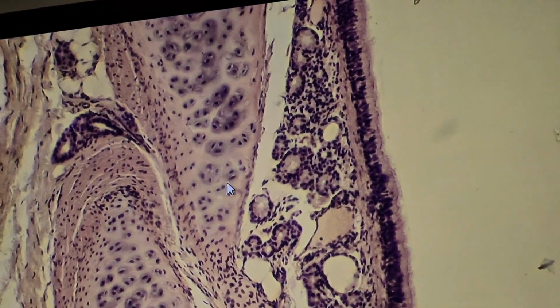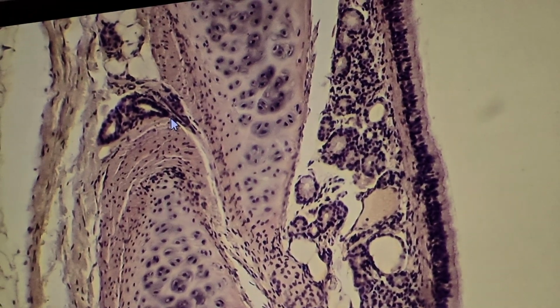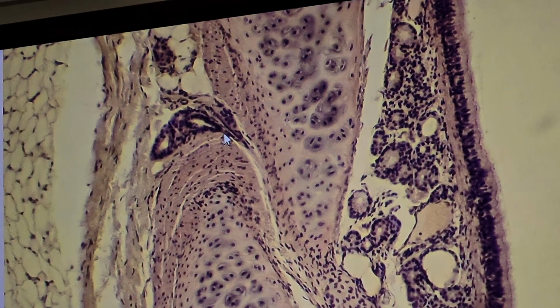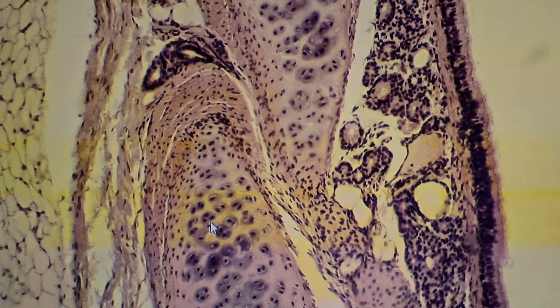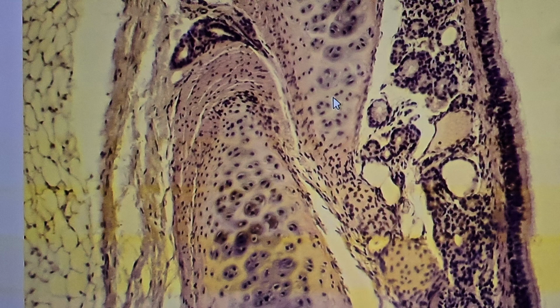Within the submucosa and adventitia, we have a series of C-shaped rings of hyaline cartilage. This is hyaline cartilage. This is one end, and this is the other end.